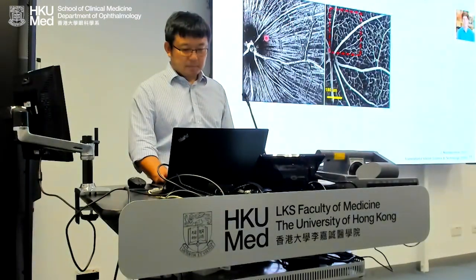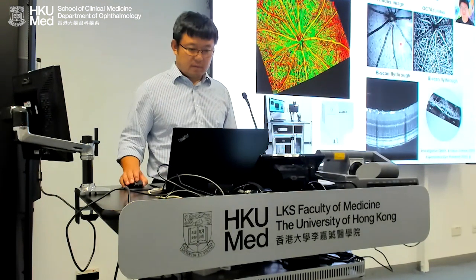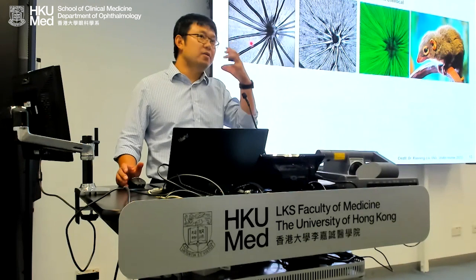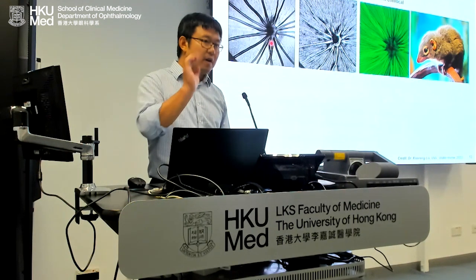So this is the OCTA fundus. And also, if you look at the quality here, this is the mouse fundus. This is a tree shrew fundus. It's closer to a primate. The eye quality is much better. So this is the OCTA quality without any fancy processing, just 5 acquisitions, that's it. And this is the fiber bundle analysis.